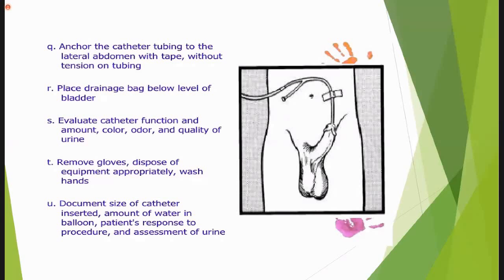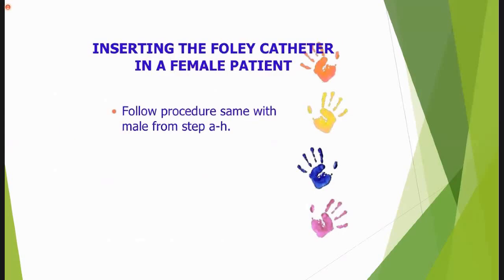At the end of the procedure, document the size of the catheter inserted, the amount of water in the balloon, the patient's response to the procedure, and assessment of the urine. All of these things should be documented in the file. Okay.